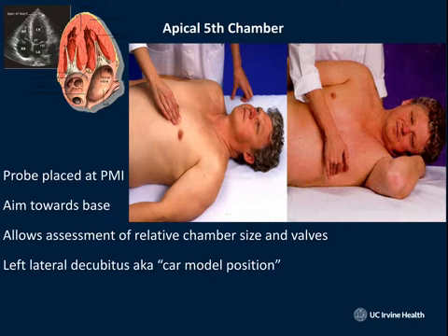So what I tell the patient is to roll over on their side and move into a car model position, as if they're going to model on top of a car at a car show. Immediately, for whatever reason, everybody knows exactly what that means. They roll over on their side, put their hand above their head, and we get to work.